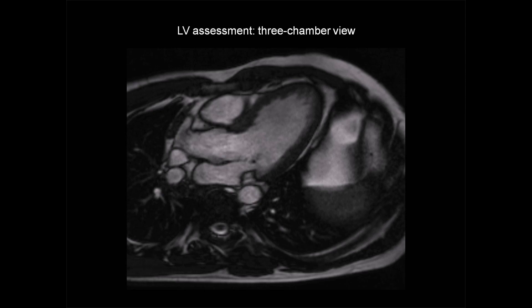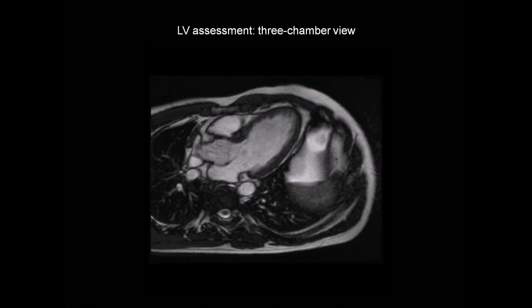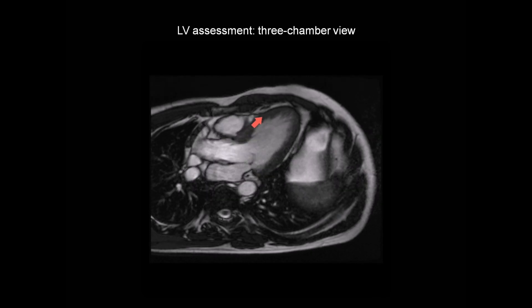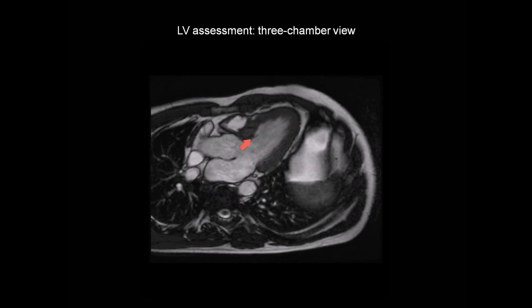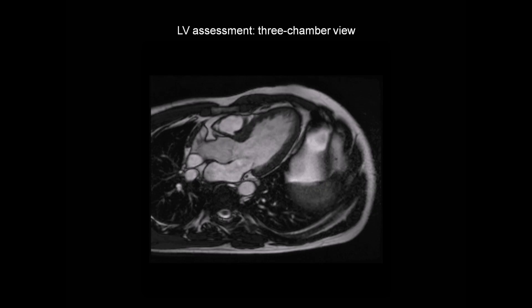Our next view is the three-chamber view. We have the left ventricle, mitral valve and left atrium, the aortic valve and aortic root, and we can just see the right ventricular outflow tract. Here we have the basal anteroseptal, mid-anteroseptal and apical septal segments, and the basal inferolateral, mid-inferolateral and apical lateral segments. The equivalent cine CMR image shows left ventricular segments with clear movement and thickening during systole, and regional wall motion is normal throughout.